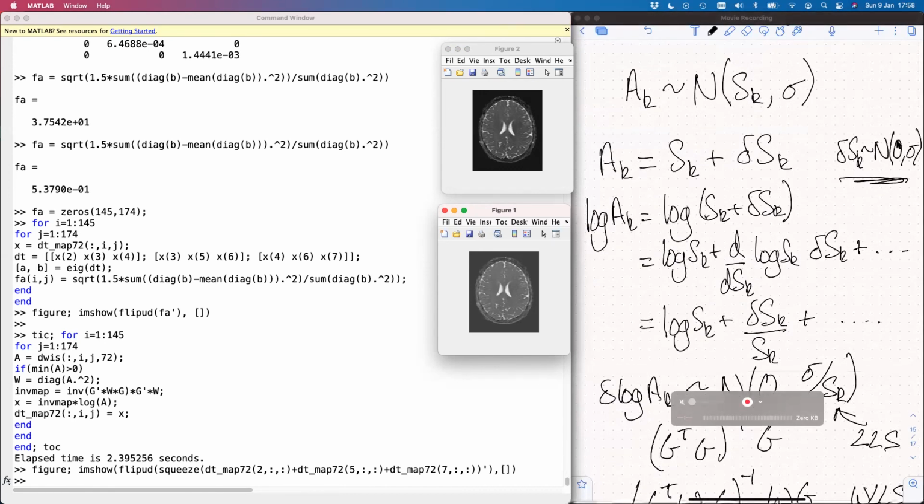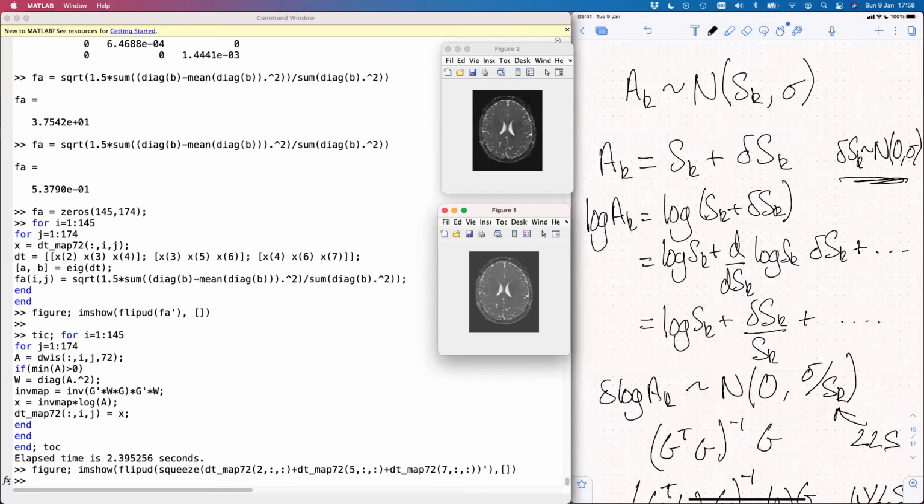In fact, there are better noise models for the noise on the MR signal than Gaussian. There are Ricean distributions, there are other ones. But using those makes the fitting much more complicated. We will look at that a bit later, but it becomes much more time consuming. So yes, weighted linear least squares remains really the standard way of estimating the diffusion tensor. Okay, that's the end. I shall stop there and I'll see you in person in future lectures.